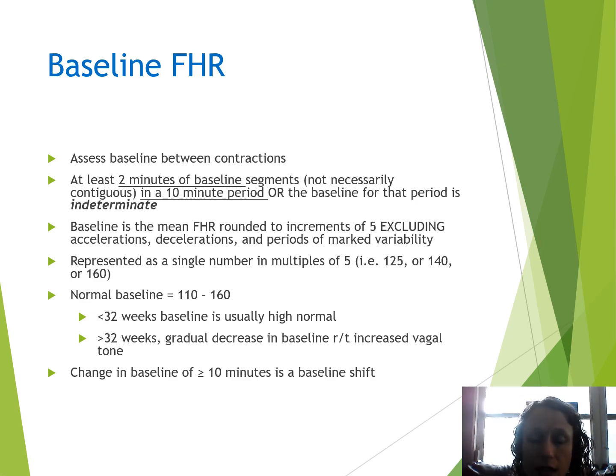You have to have at least 2 minutes, and then it can't change for more than 10 minutes. Say my fetal heart rate's 120, and then I have an acceleration, and I'm like, oh, that's cool, they did an acceleration. I'm watching it, and it's 150, and it continues, and it's still 150, 5 minutes later, 6 minutes later. Once it gets to 10 minutes, it's actually now changed. Our baseline fetal heart rate has changed.